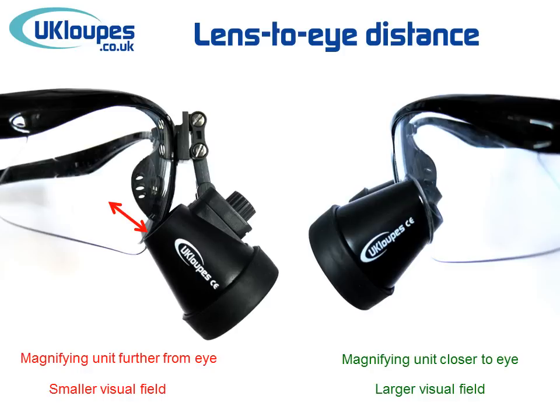Although the difference between the lens to eye distance is small between the flip-up loupes and TTL loupes, the greater visual field that is achieved by the TTL lens arrangement is the major reason why wearers of TTL loupes prefer them over flip-up loupes.